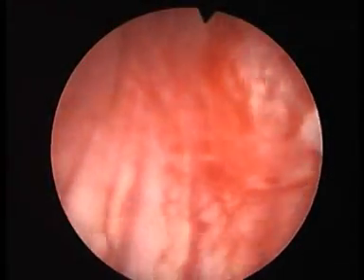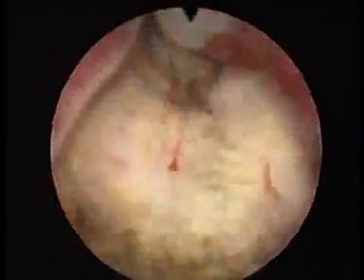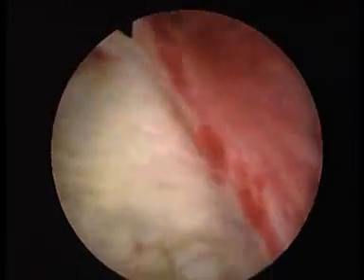There's the metal loop. Just taking the first chip now. Our procedure is performed under water and the irrigant itself is designed not to conduct electricity.